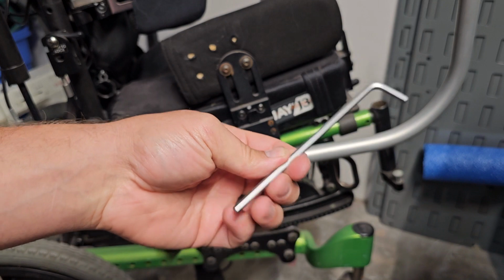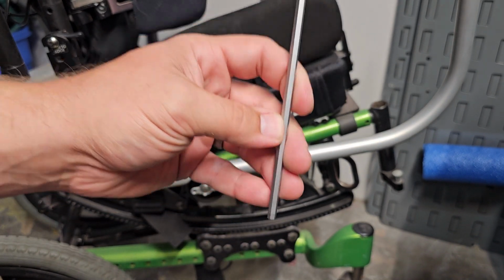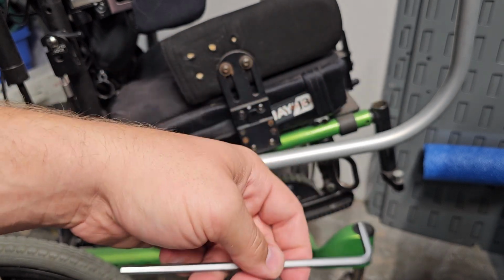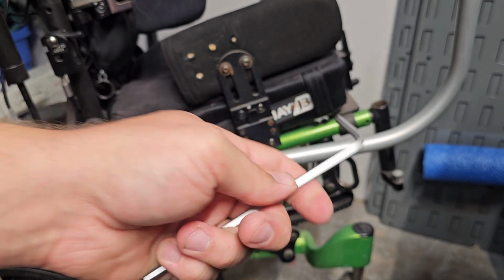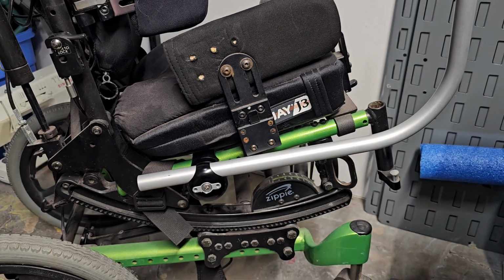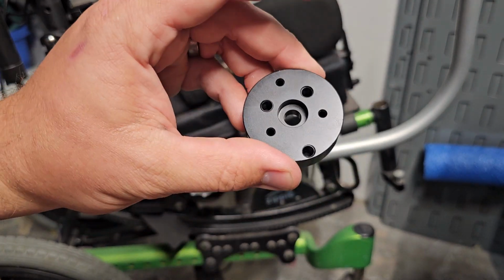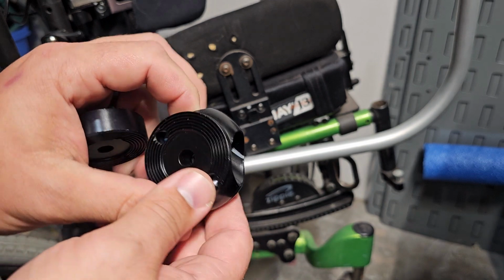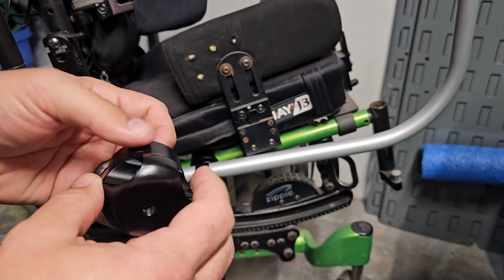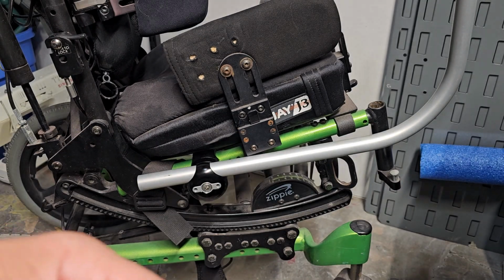So far, the whole mounting process has taken just this one Allen wrench. This one Allen wrench is the one you're going to mainly need. There is one more Allen wrench that does not come with your kit, but you'll need it for the switch hitter, and I'll show you that shortly. Now, mounted onto your switch hitter are these two brackets. They come already mounted. These brackets do not have to come off. They can stay on the switch hitter the whole time for easy installation and for helping not getting them lost.